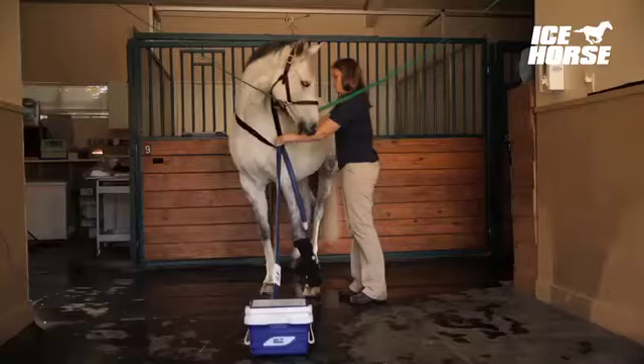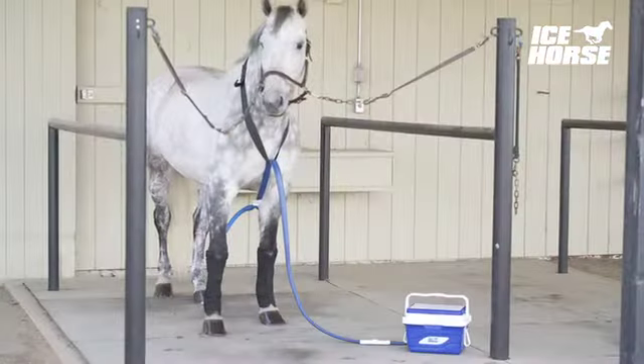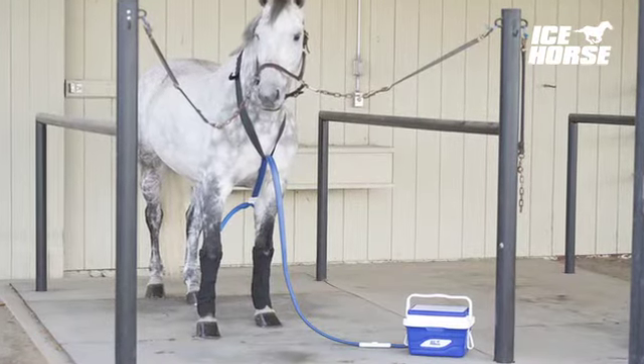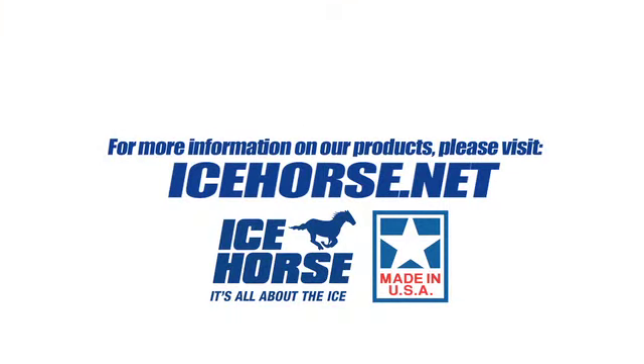For safety, run the cooling hose through the velcro martingale provided. Finally, attach the wraps to the horse's legs and plug in the cooler. Regulate the temperature using the adjustment dial. Icehorse — it's all about the ice.